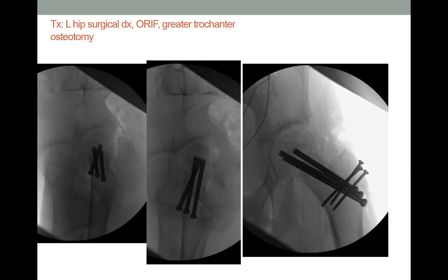So you're plugging that into the femoral head? What are you doing? You thread it through the cannulated screws. The screws are cannulated, and the monitor is a very thin tube. Just stick it up there so you can see it. How reliable is that?